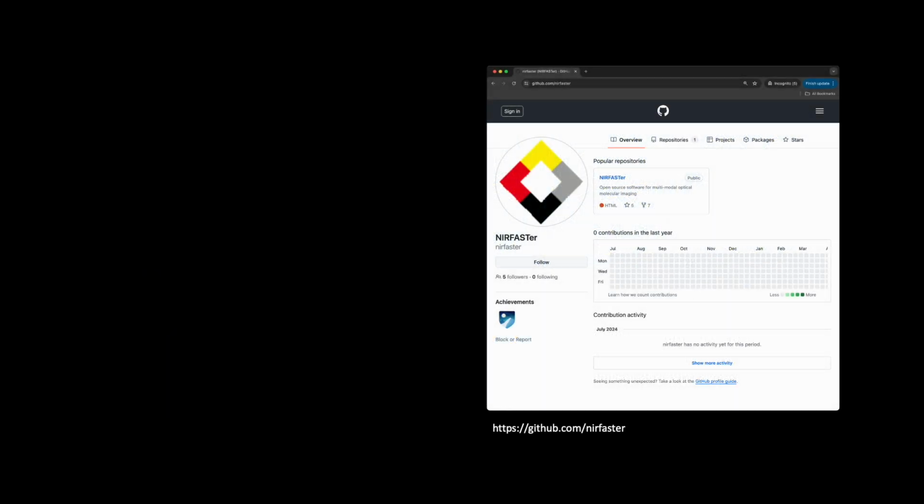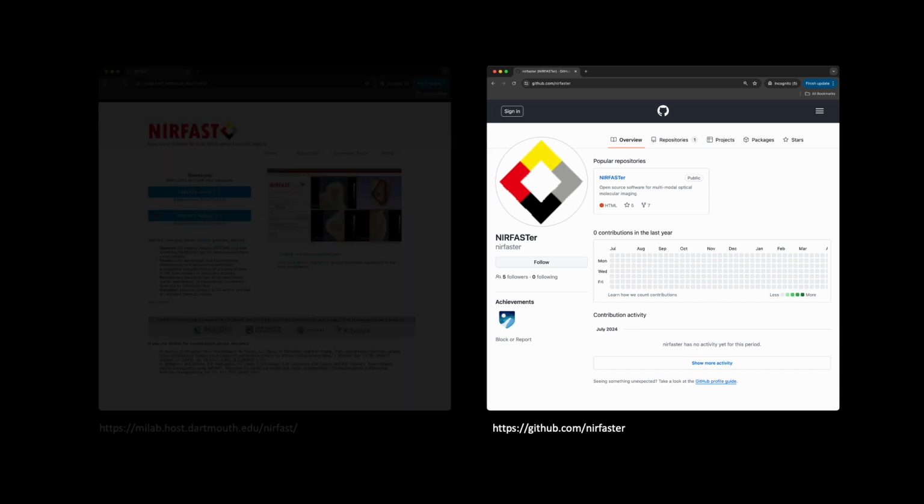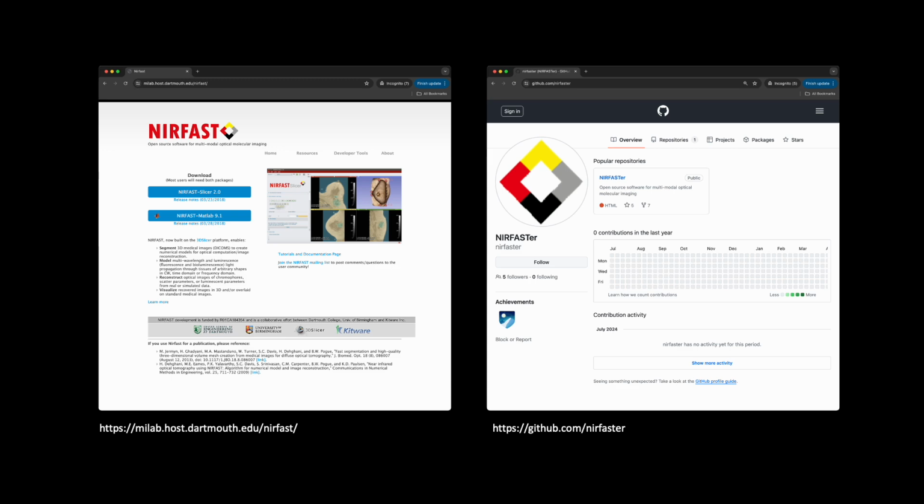Fortunately, sophisticated packages for finite element modeling have been made available by several groups in the imaging community. NeuroDOT uses the NIRFASTer toolbox. The software was developed in a collaboration of Kitware, Dartmouth College, and the University of Birmingham. It is a successor to the NIRFAST toolbox and introduces new solvers and expanded capabilities.